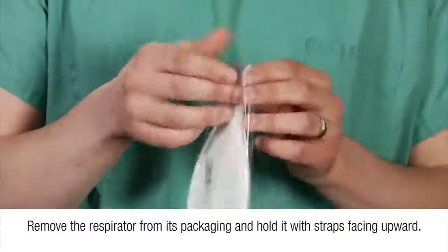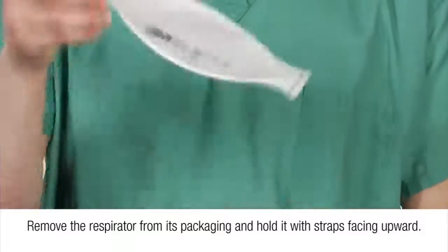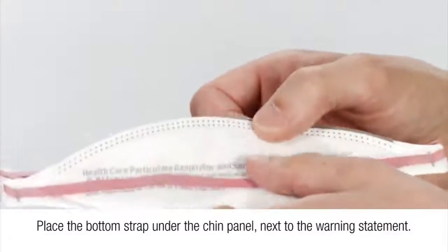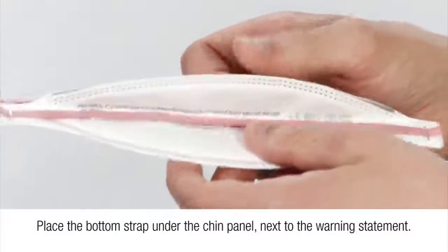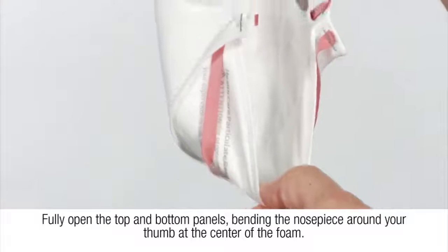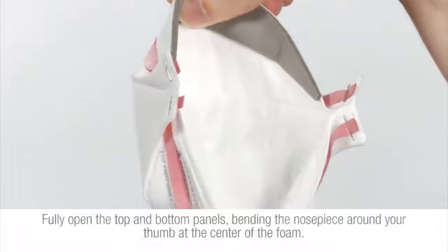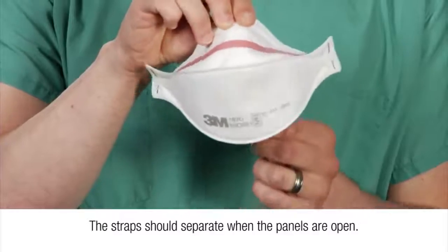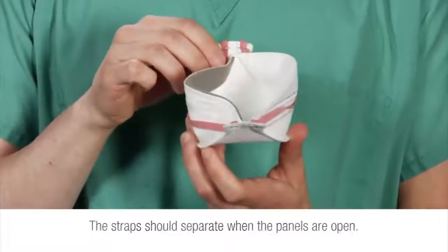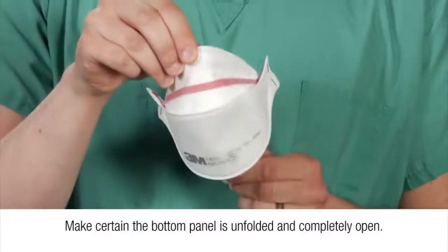Remove the respirator from its packaging and hold it with straps facing upward. Place the bottom strap under the chin panel next to the warning statement. Fully open the top and bottom panels, bending the nose piece around your thumb at the center of the foam. The strap should separate when the panels are open. Make certain the bottom panel is unfolded and completely open.